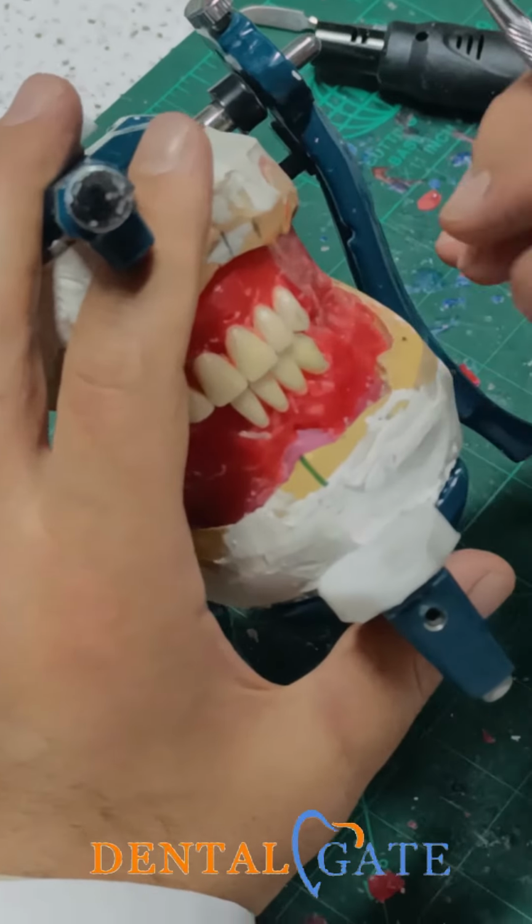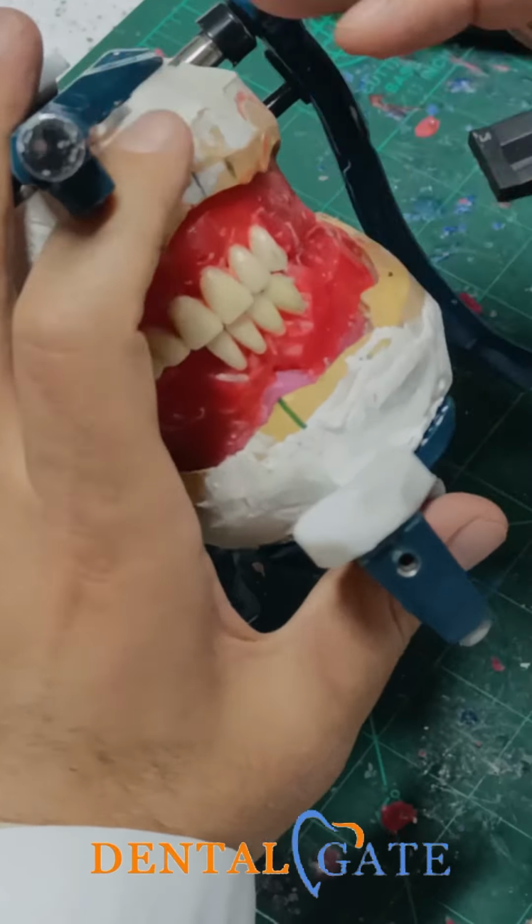That's it. I think make a double check here. What's your opinion about that?